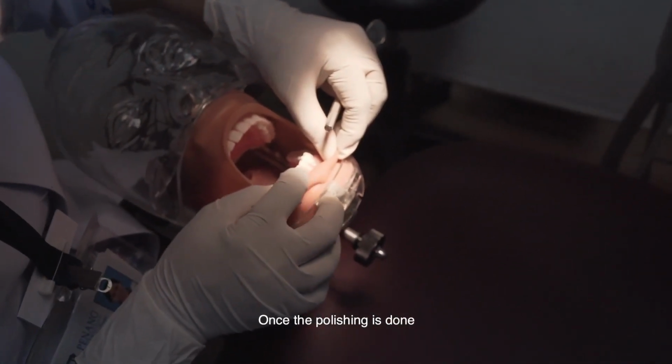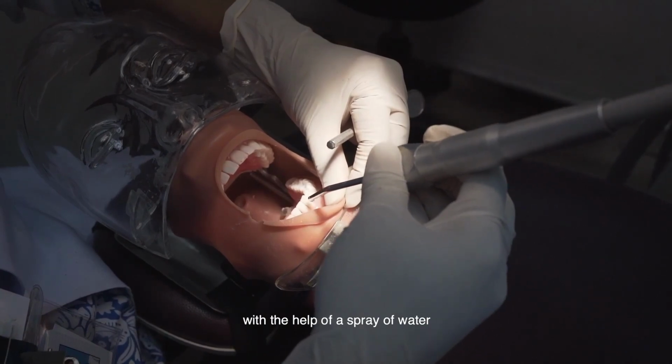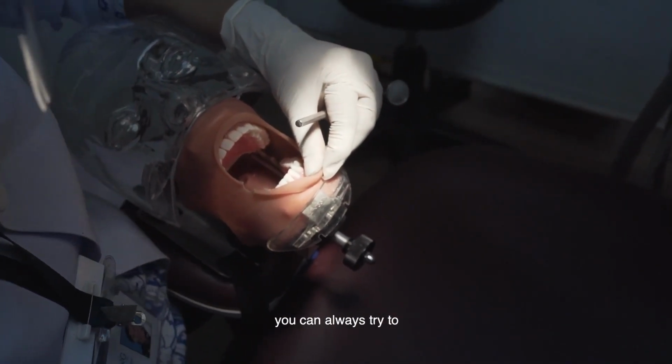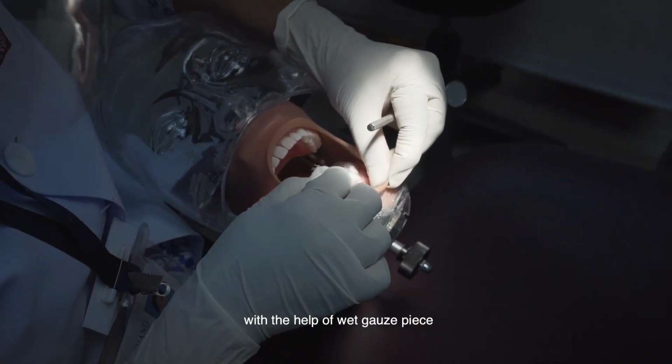Once the polishing is done, you do have polishing material left out like this. So always try to clean it then and there with the help of a spray of water. After the spray of water, you can also check for the lustrous effect with the help of the wet gauze piece.